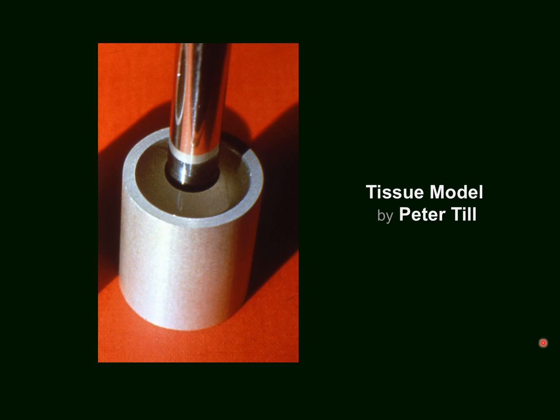And every standardized instrument since then is delivered together with such a tissue model, which is needed not only in the beginning of examinations with an instrument and a particular probe, but also over time to check the tissue sensitivity, which may weaken when the probe weakens. It is determined for each instrument and probe combination.